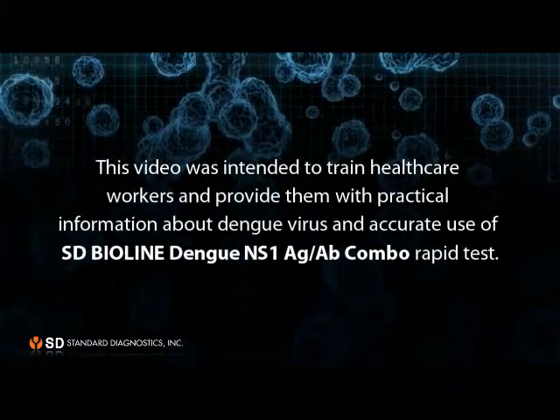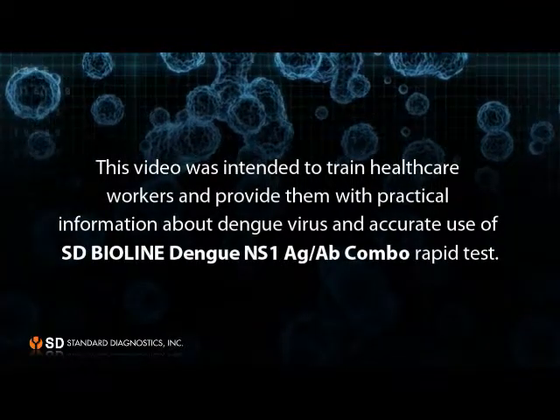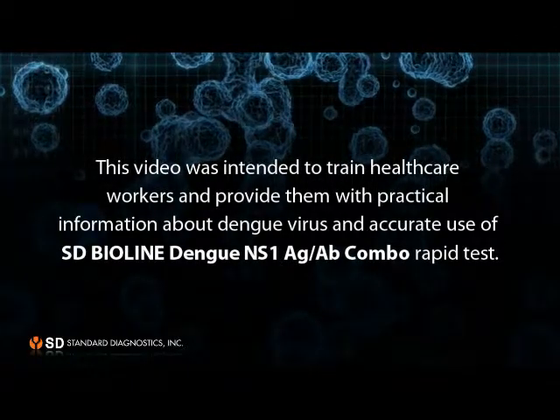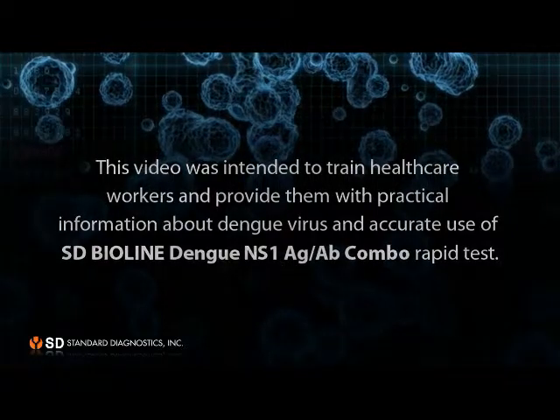This video was intended to train healthcare workers and provide them with practical information about the dengue virus and accurate use of the Bioline Dengue NS1 antigen antibody combo rapid test.